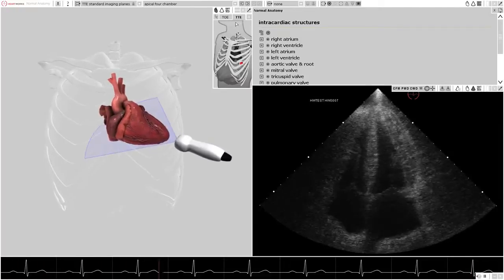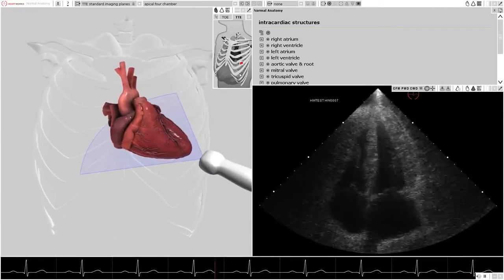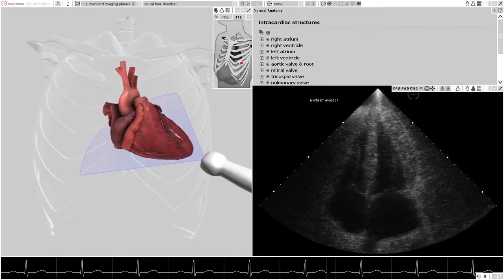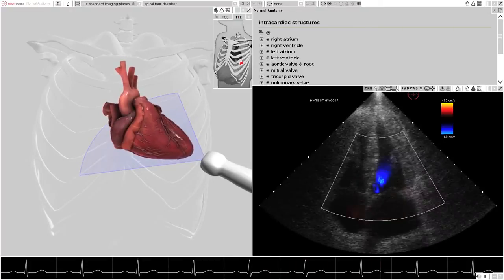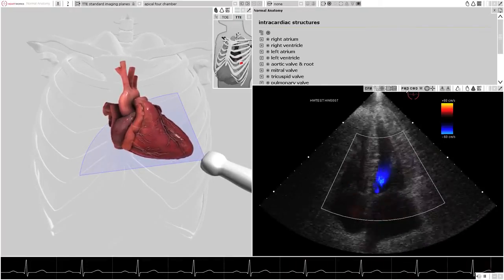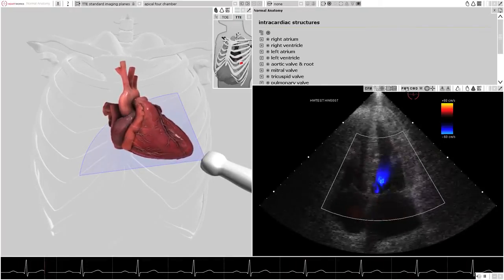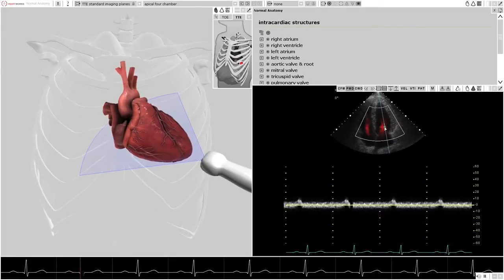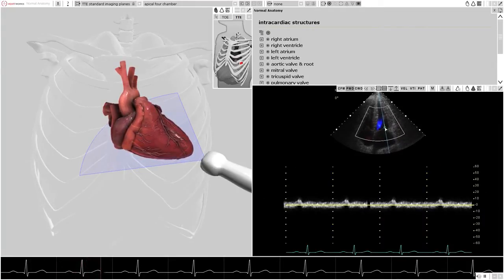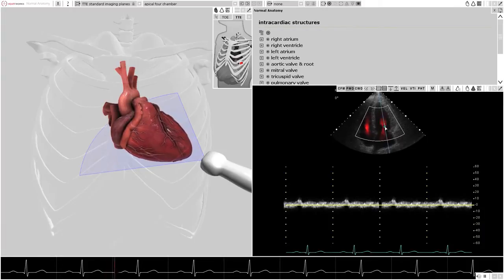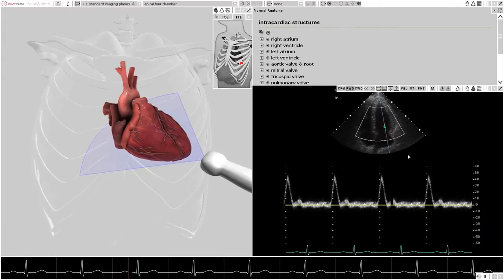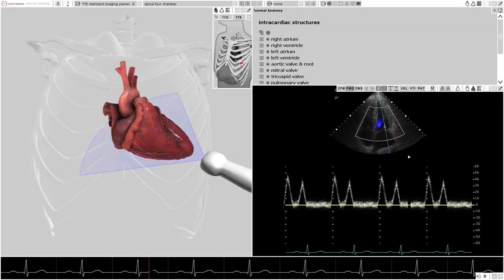There are no on-screen controls of the TTE probe. The haptic device must be enabled to acquire an image. The display will include a semi-transparent representation of the chest wall. All of the Doppler and measurement capabilities, as well as the text browser functions, are available in this mode.